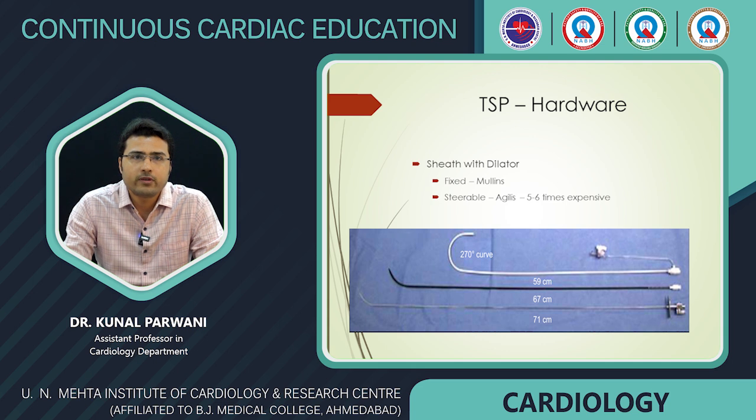This catheter has a 270-degree curve at the end that is straightened by the dilator, and it is most widely known as a Mullins catheter. It is developed by Medtronic. The radius of the end of the catheter is available in different sizes, allowing variable reach within the RA.